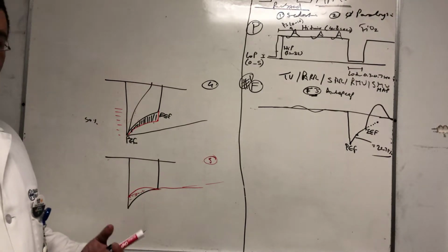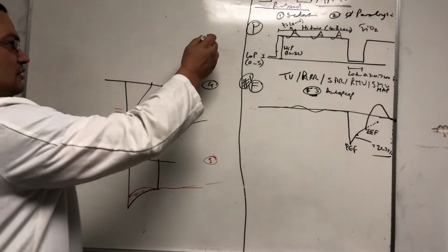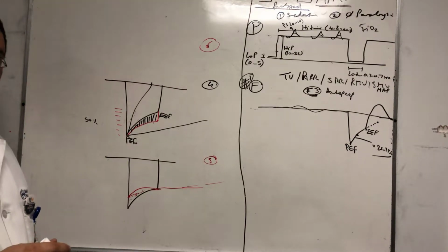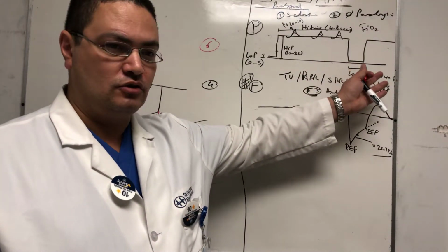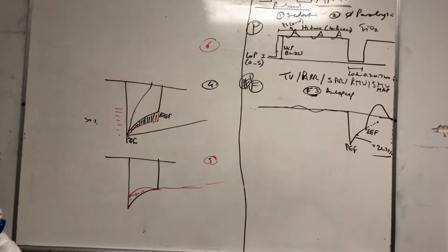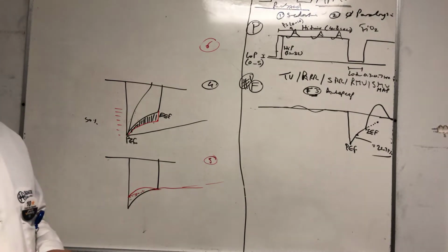Which brings me to the eternal question. Can you use, which is another claim to fame here, can you use APRV, classic APRV, for a patient with COPD? Because the exhalation is so short, this could be a problem. And it is, it could be a problem. But the advantage is, this is a window into your lungs. You will know what's happening to the patient.